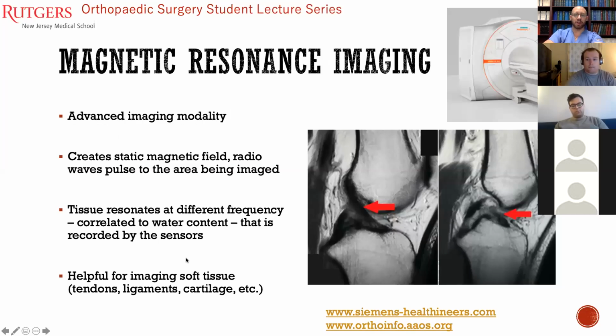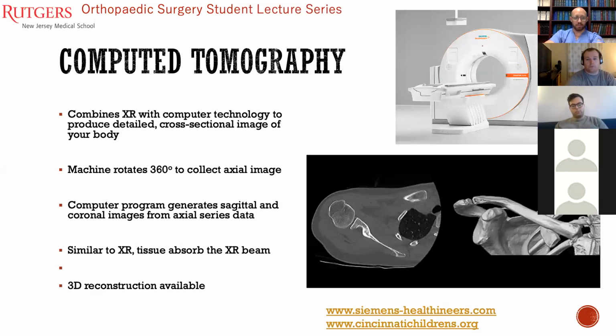Jeff, just want to point out one other thing. So most of the time we're getting CT scans for things that are more complicated, like Jeff said, or intra-articular, but most of orthopedics is focused on the bones, and a lot of times we also get CT scans with contrast to look for abscesses. You can switch it to a soft tissue window and better evaluate the soft tissue and see if there's any abscess or cellulitis or other thing involved, which CT will help you with.